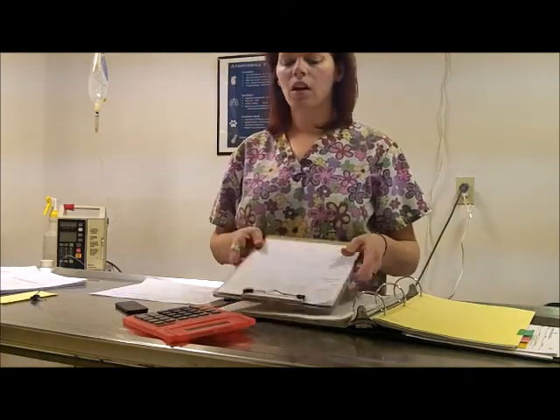Once our anesthetic procedure is finished and the patient is safely in recovery, it's time to gather all of the important documents to complete the medical record for today's procedure. First document that you want to make sure is completely filled out is our anesthetic monitoring.